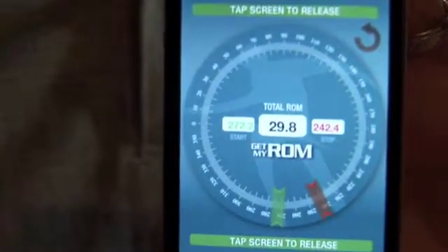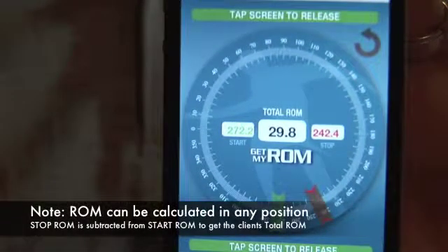The measurements are now saved in your iOS device. Total range of motion is calculated by subtracting the stop range of motion from the start.